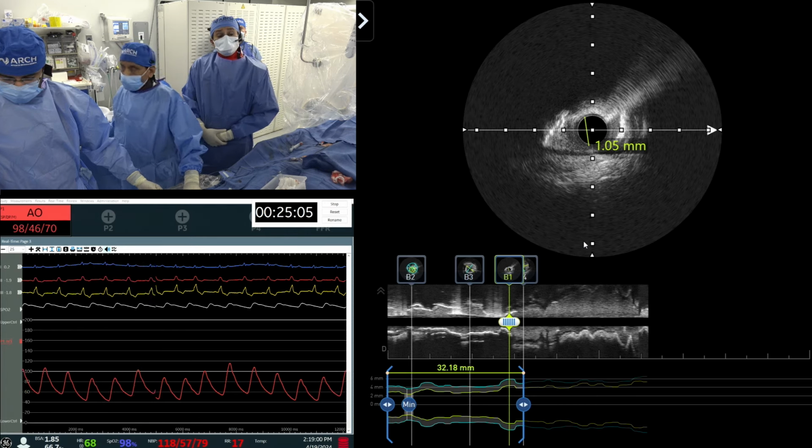And I think your comment, that you said multiple times, that IVUS does not allow them to get information, is good. Still, a live case.